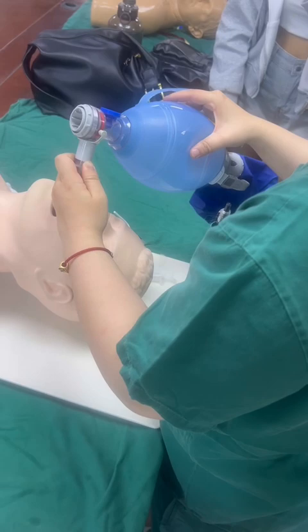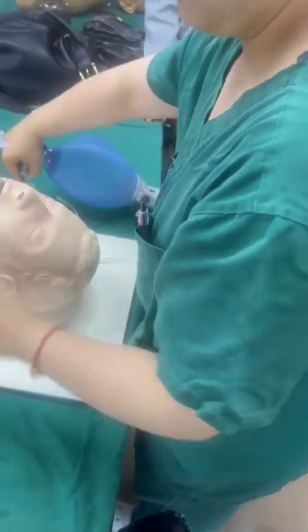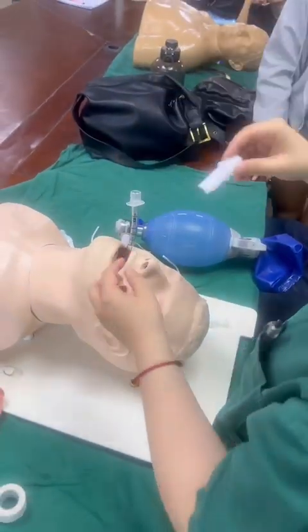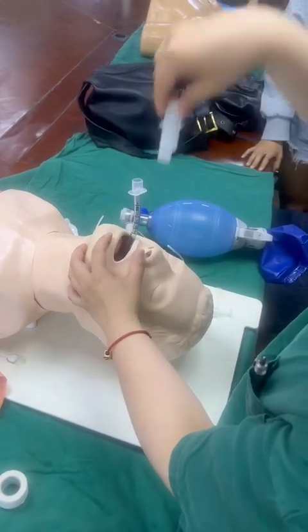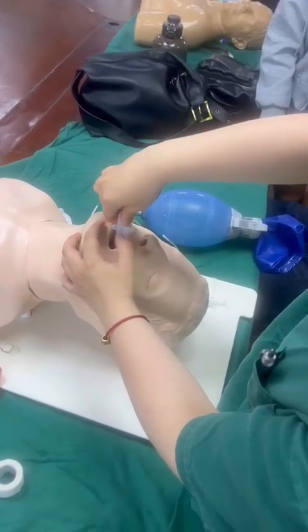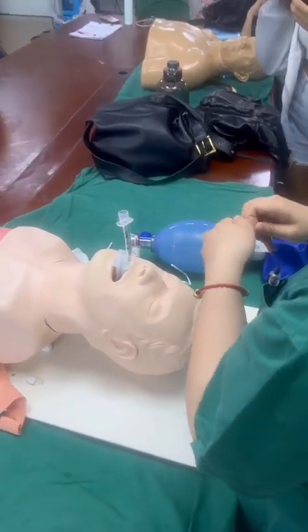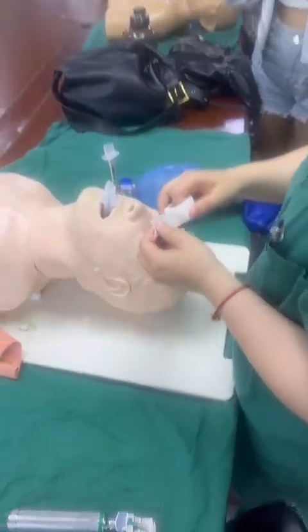We can confirm and fix it. Insert the teeth cushion. If the mouth is closed, we can open it and insert from here. Use the tape. So if you first give oxygen and then put the teeth cushion. Yes. Okay.